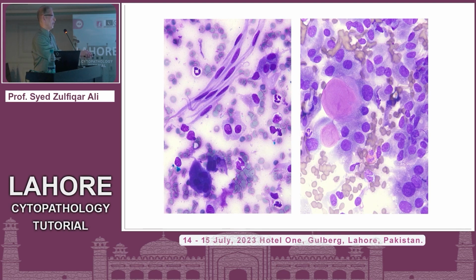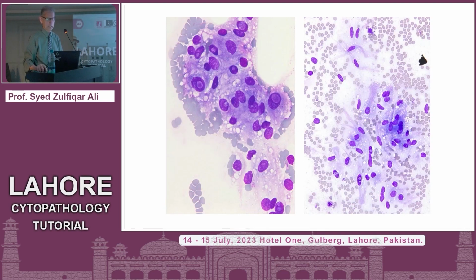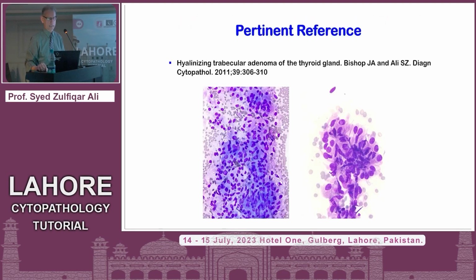They can have hyaline walls, again, basement membrane type material. They can be very vacuolated, but still containing intranuclear inclusions. They can be very spindly. Interesting, even when they're spindly, they still have intranuclear inclusions. So again, too good to be true. Remember that. That's the theme.